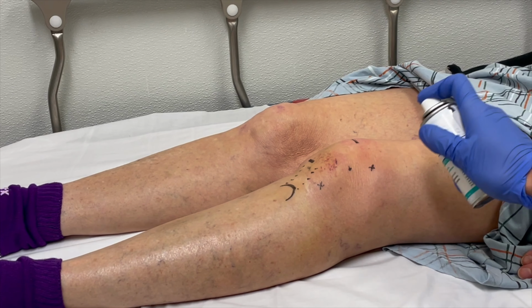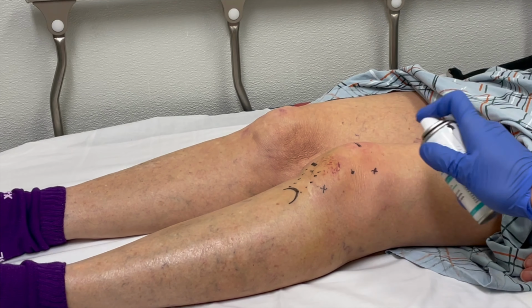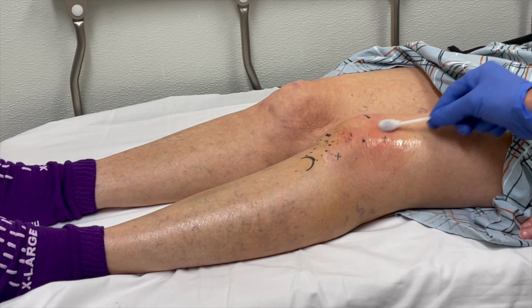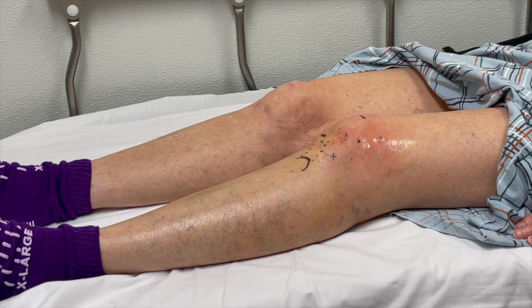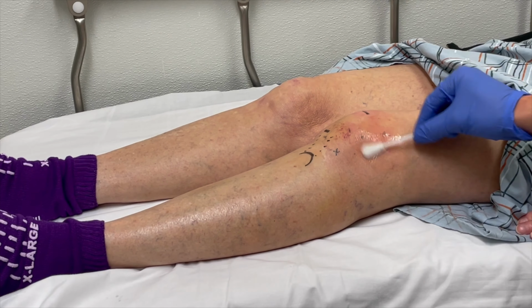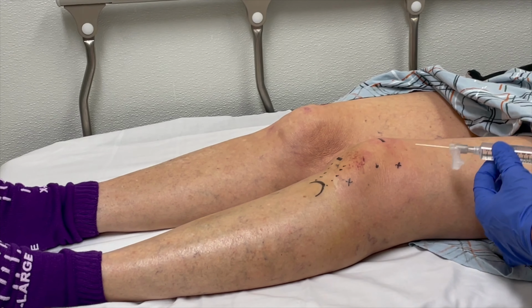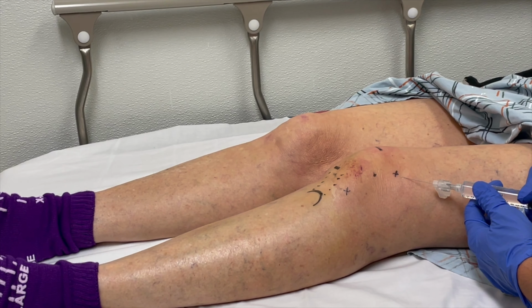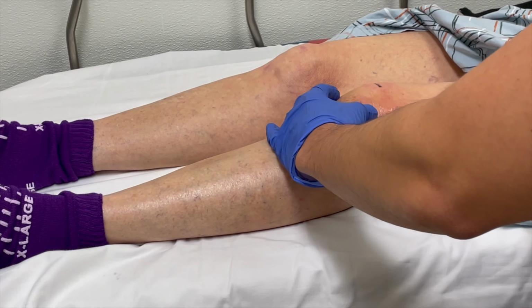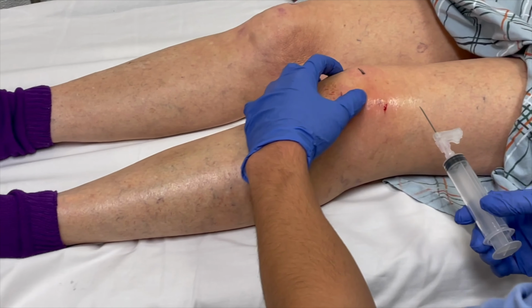The skin is sprayed with ethyl chloride spray to prevent discomfort from the lidocaine injection. The skin is then prepped with ChloraPrep sticks. Next, the skin is injected with 1 to 2% lidocaine without epinephrine, and then the knee is aspirated. Feel lateral pole of patella.